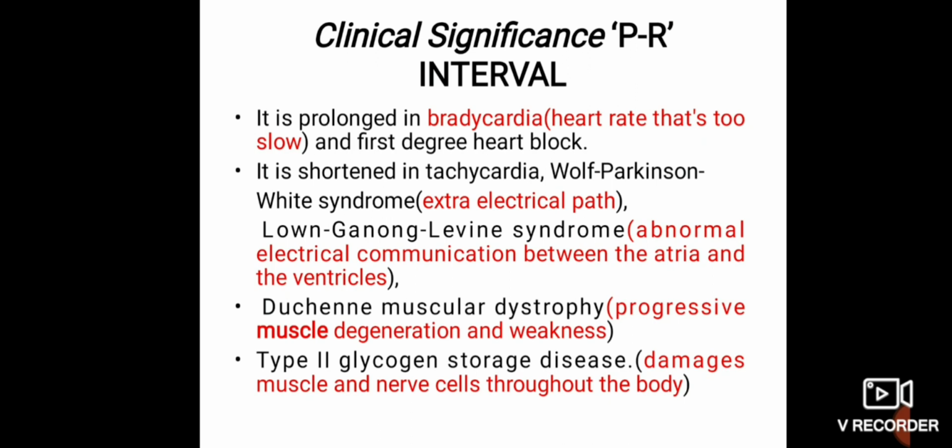These are some of the arrhythmia conditions that happen when people have heart rate deviations or improper rhythmic conditions. So they need a proper diagnosis with a cardiologist. And this is the intro about our ECG recording.